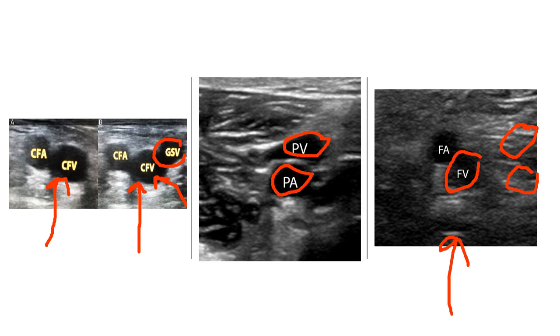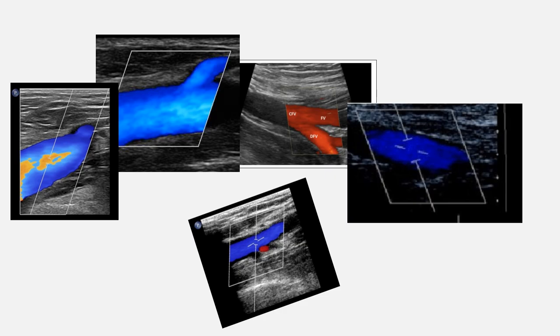Here are what our SAG pictures should look like. Of course, we're going to be Dopplering and augmenting these if it was proven patent. The only thing that I would say is that we want to keep the consistency of our color representation the same. So just like how we learned aorta, where our proximal region kind of goes up our screen, our mid region kind of goes straight across, and then our distal regions kind of come back down on an angle.